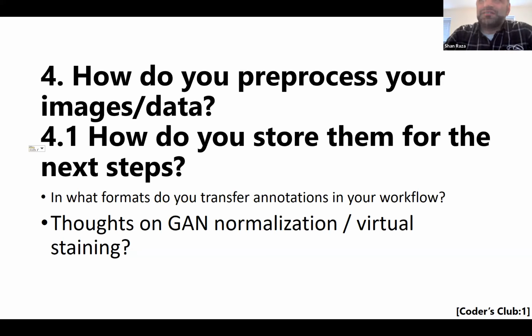Sorry, go ahead. On the storage, there's a discussion going on in the chat about converting the SVS to TIFF. What we are looking for now is the Zarr format. There's been a recent paper on OME-NGFF. That's what we are looking for. We have just tested a few examples. We have compared that with DICOM, SVS reading, and TIFF as well. And Zarr is, in our tests, at least 3 times faster than DICOM and 5 times faster than SVS in reading any random regions. And that's what we are going to use for the whole slide images. If anyone is interested, there's open source code available for that as well.